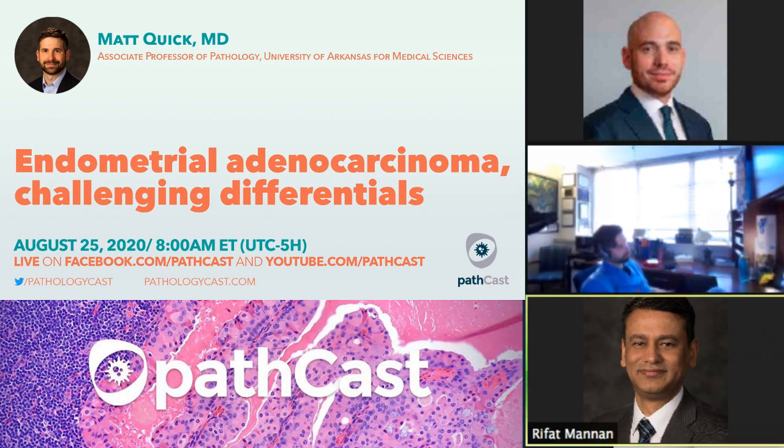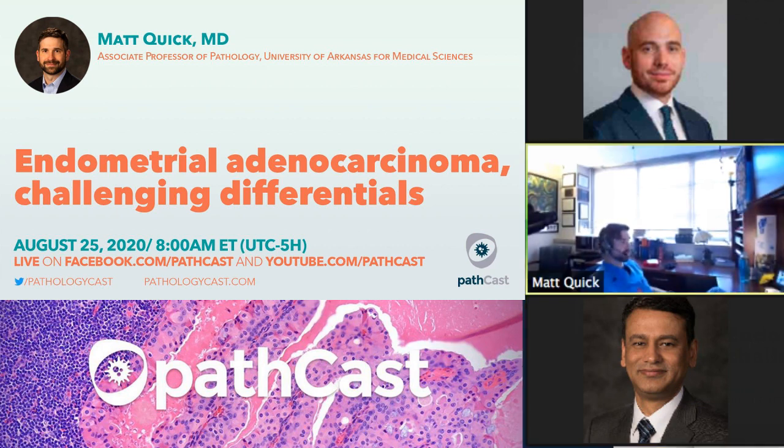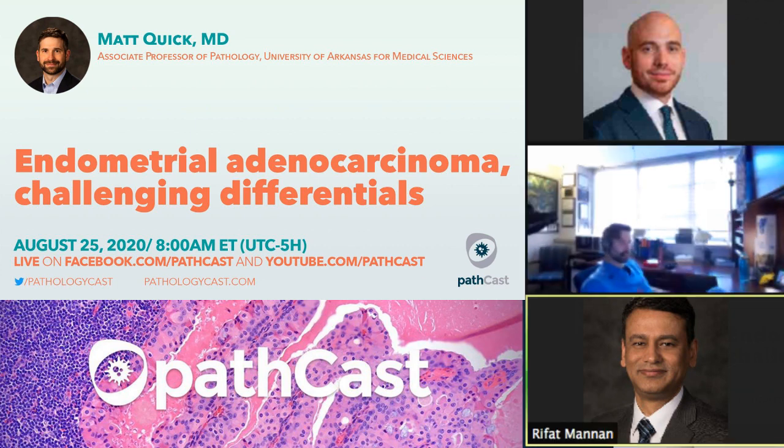Thanks. There is another question that's from Azaz Khan. If only MLH1 is lost, can we call it MMR deficiency? If one is lost, it depends on which one. The question is about MLH1. Oh, okay. Sorry, I just heard one.